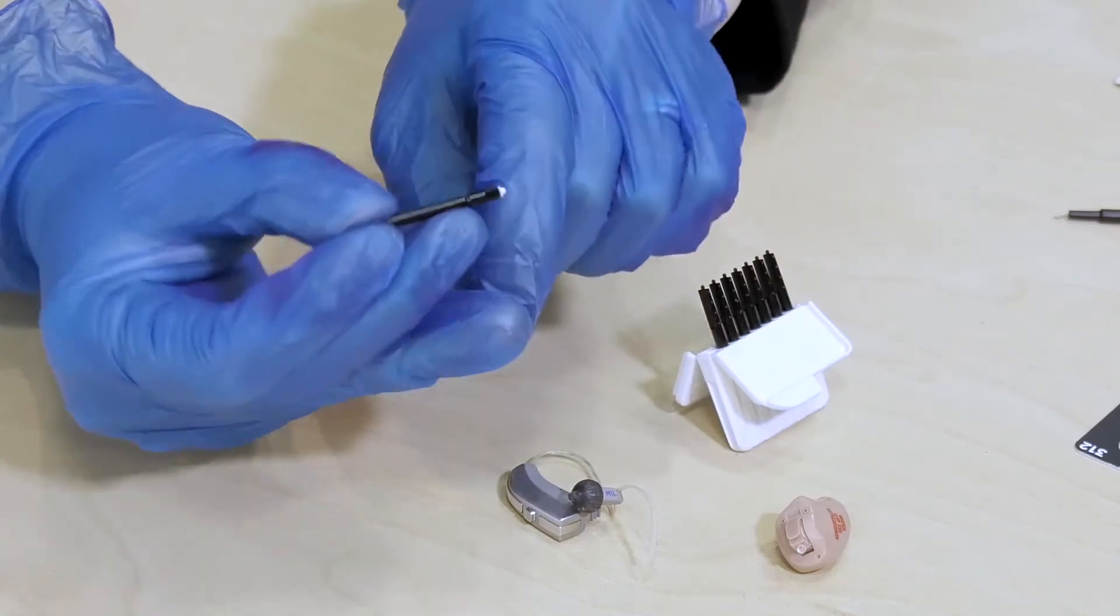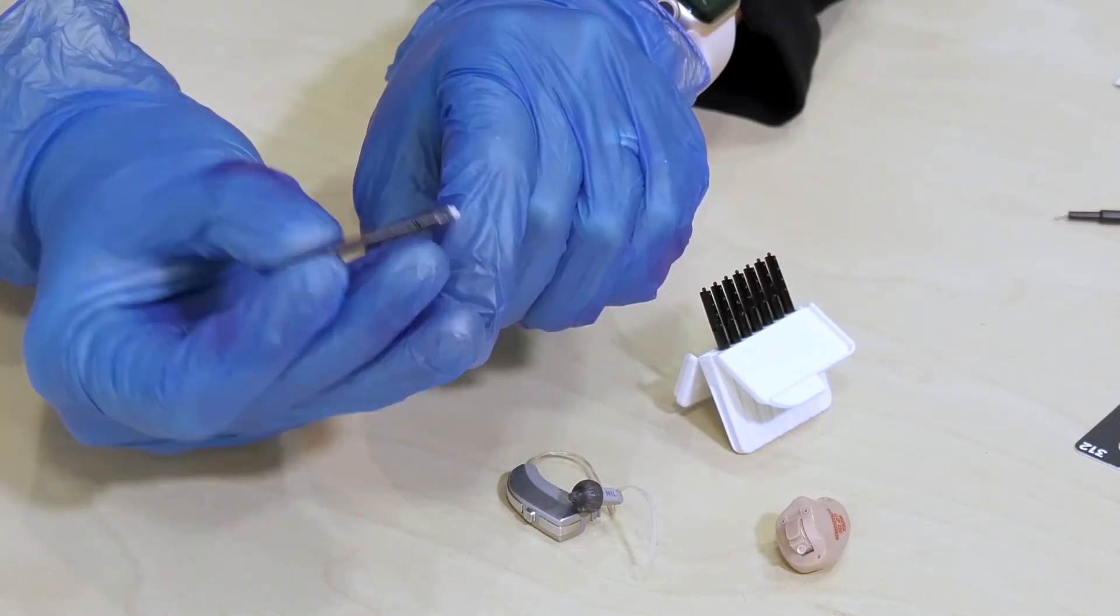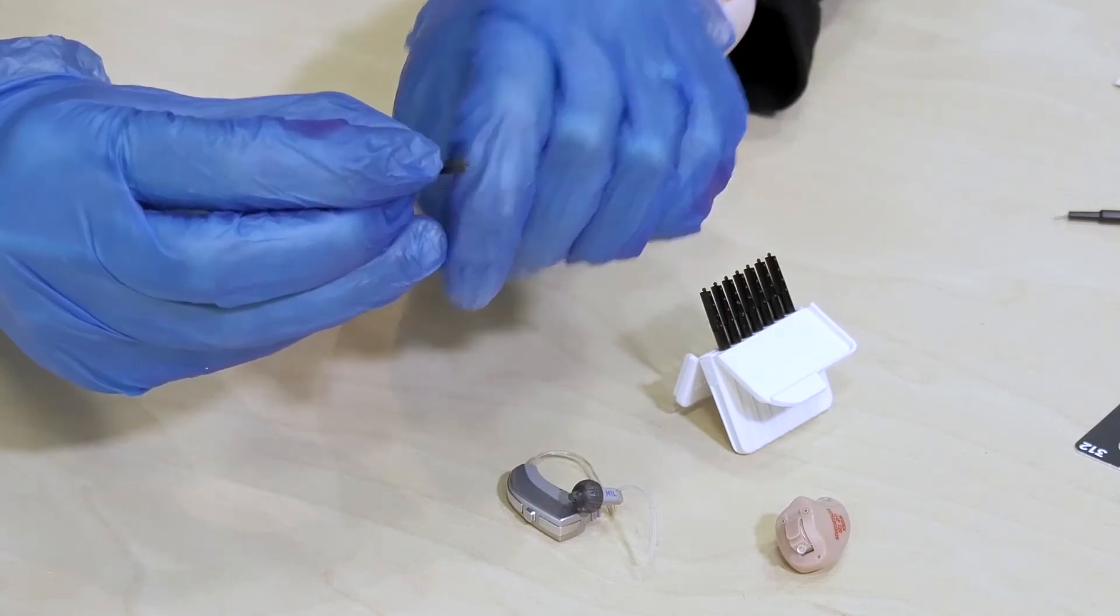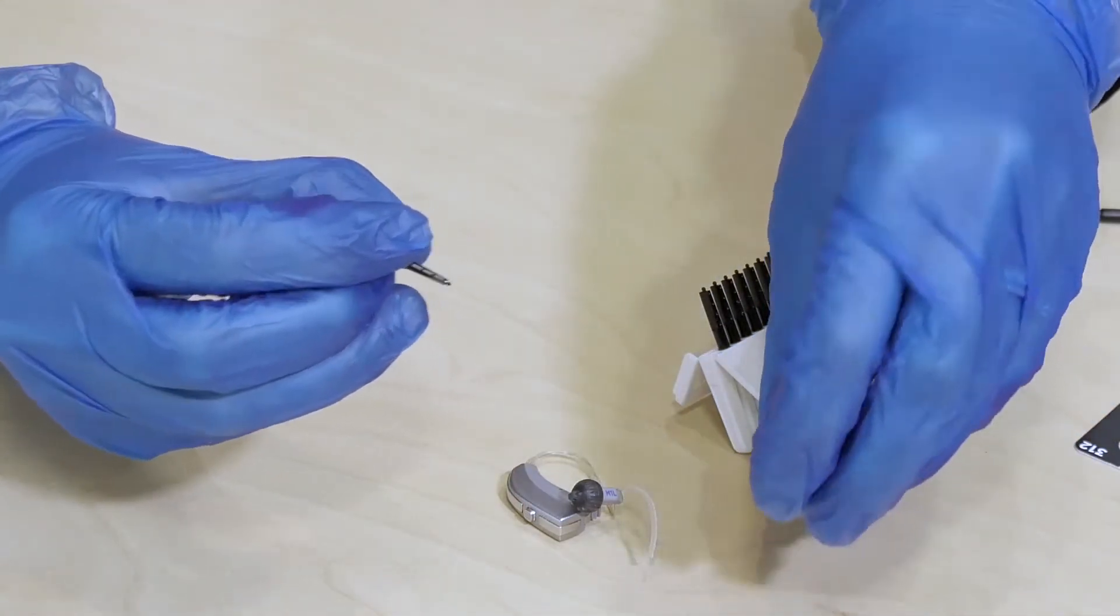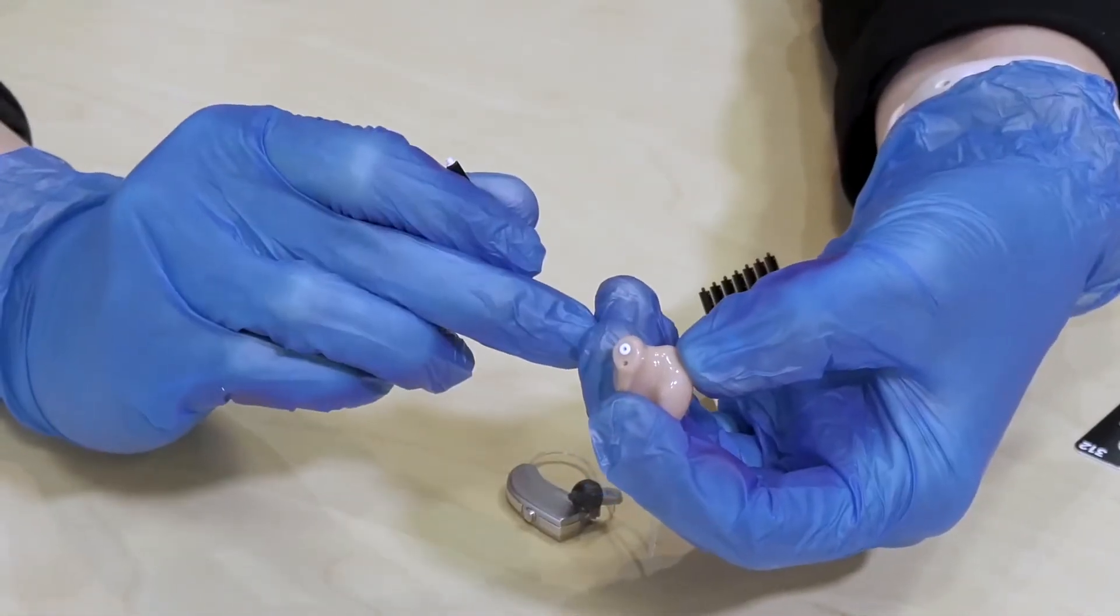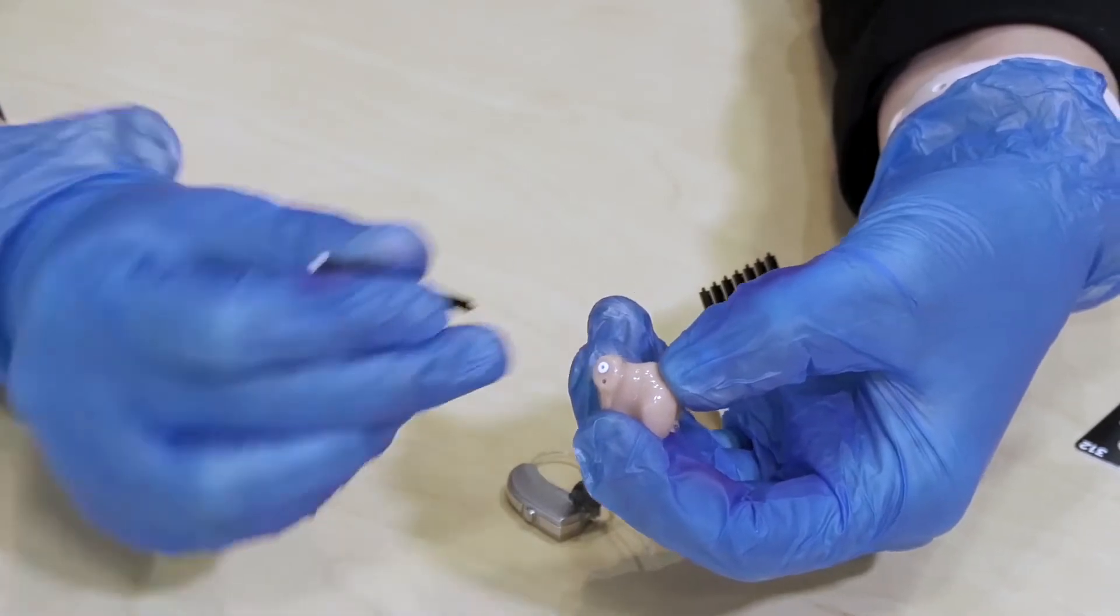Now you'll notice on one end there's a new little white filter and on the other end is just kind of a little barb device. Now in the custom one the only step that you need to do is to locate the old little white wax filter in the hearing aid.